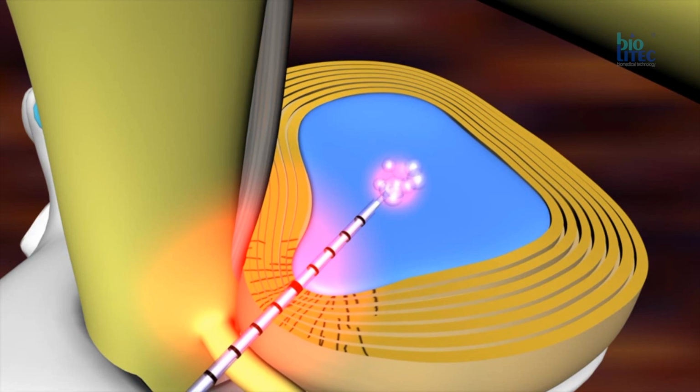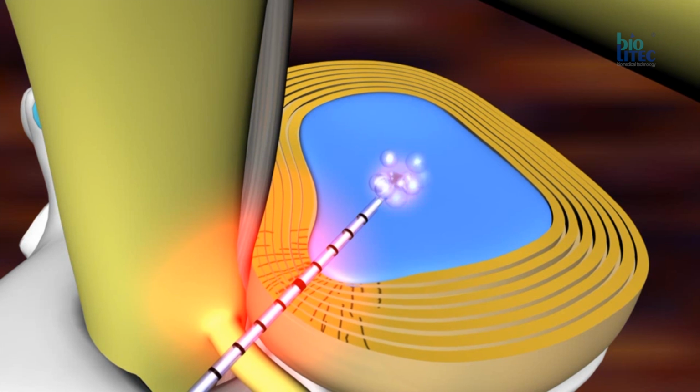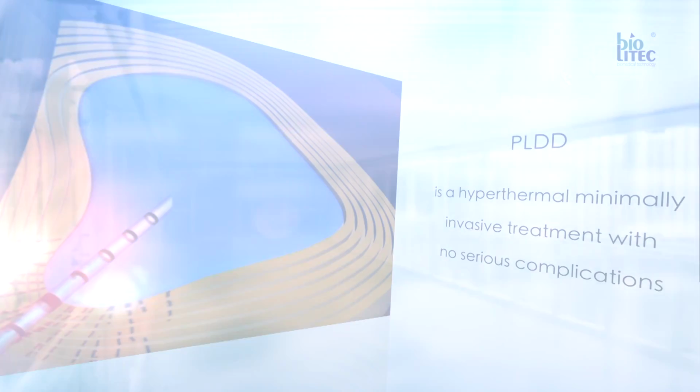The advantage of PLDD is the minimal invasivity and the avoidance of significant soft tissue injuries. No serious complications are described, especially no risk of peridural fibrosis or scarring. PLDD is an outpatient treatment. It is performed under local anesthesia or mild analgesic sedation. Patients have a minimal recovery time compared to microdiscectomy, and the costs are much lower.